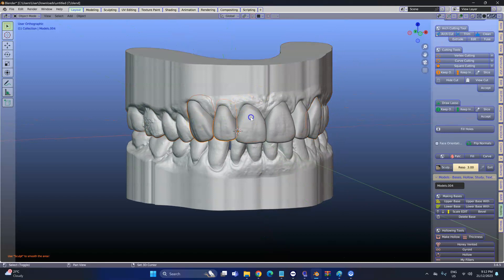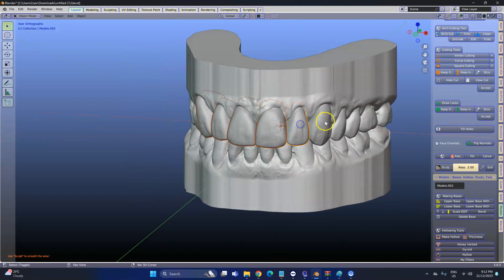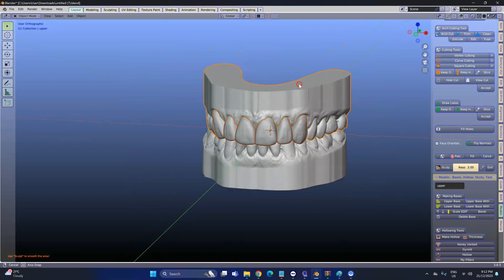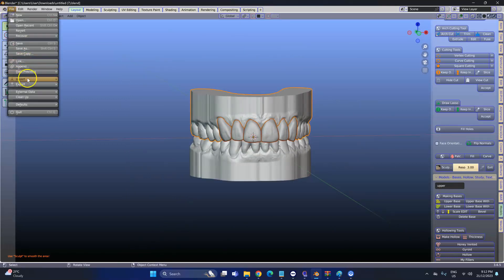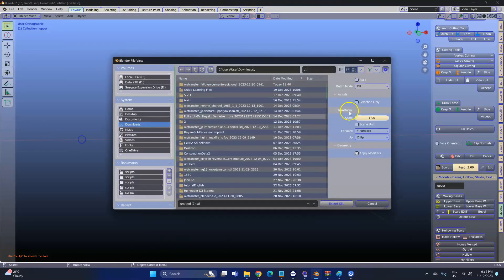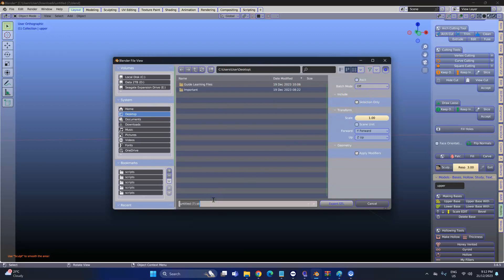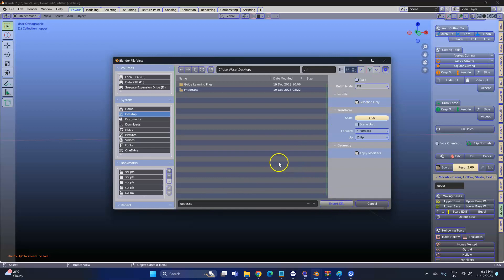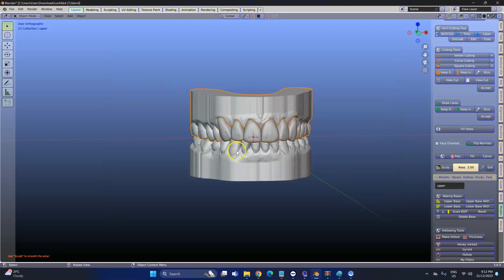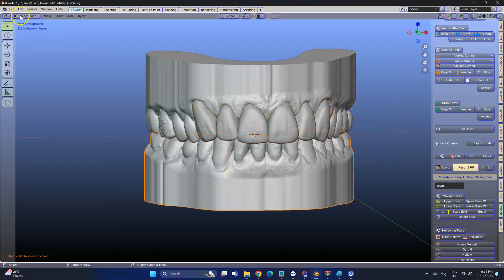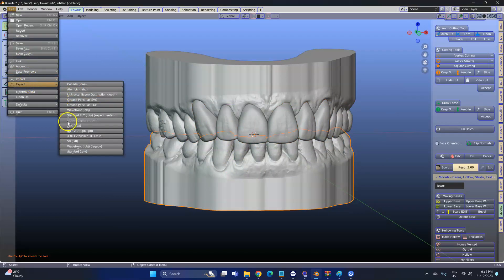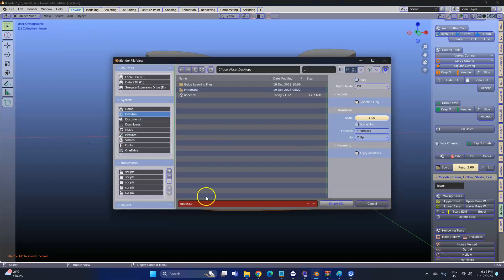Then I'm going to select all of these. Go to File, Export, STL. Click the selection box, find yourself a good place to save it. This is my upper — Export STL. They will all be linked in one STL file. Select your lower — File, Export, STL — and this is going to be my lower.